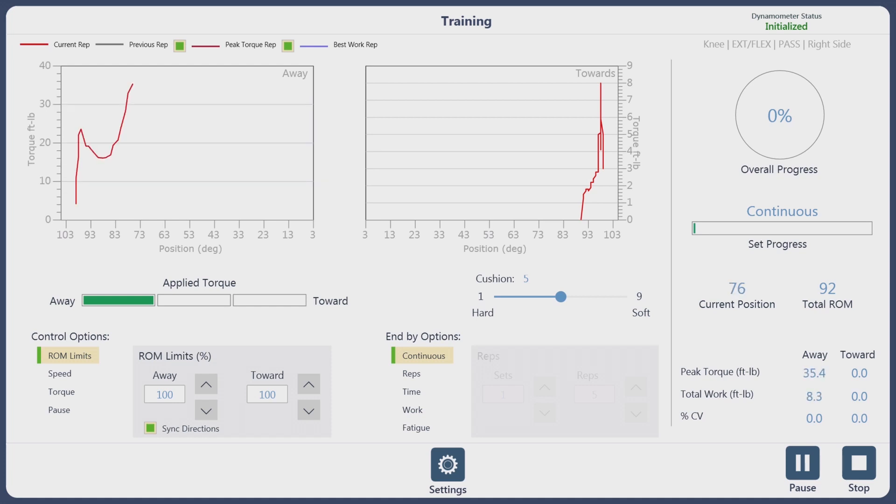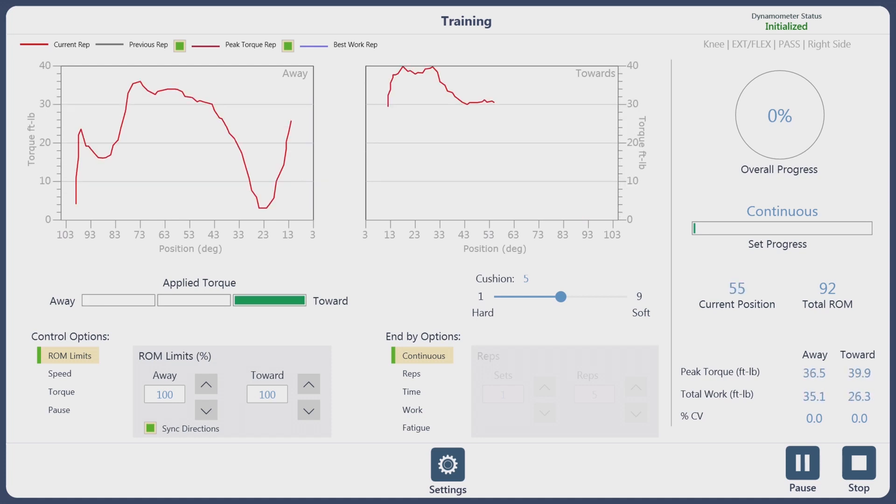In the training screen with passive range of motion, the patient can relax and do nothing. What will appear on the screen is the weight of the limb on the torque curve screen. If we go over to the far left, you'll see the options you have the ability of changing and adjusting.